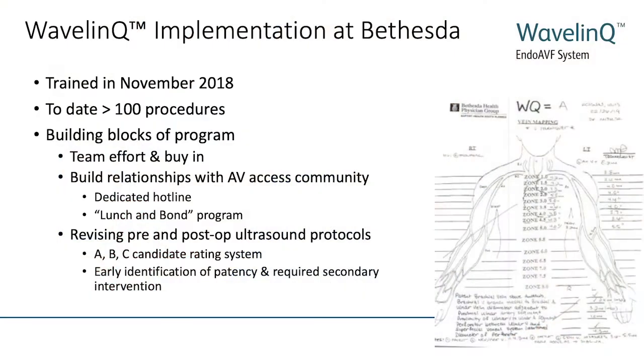In addition, in our area, we have technicians cannulating, and although we would love to have ultrasound-based cannulation, we don't have that. And so it's been really important for us to support our dialysis centers, really from the first cannulation right through successful 2-needle cannulation and then ultimately removal of their tunnel catheter. So we started from scratch.